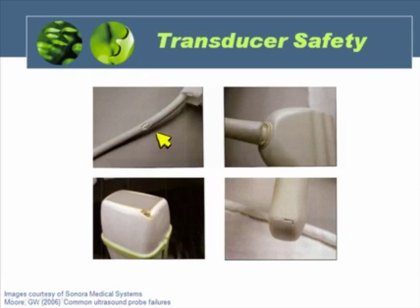Again, make sure you inspect your transducers for problems with the connector, the wires, or the housing of the transducers to ensure that there are no cracks. Not only will this degrade image quality, most importantly, it causes a potential electrical hazard to both you and the patient.